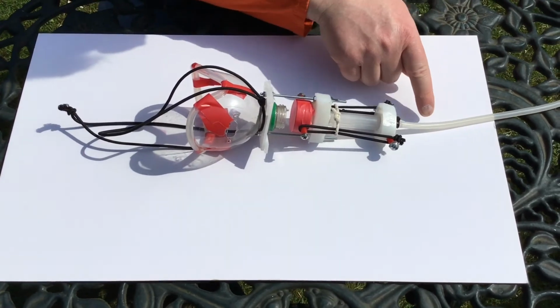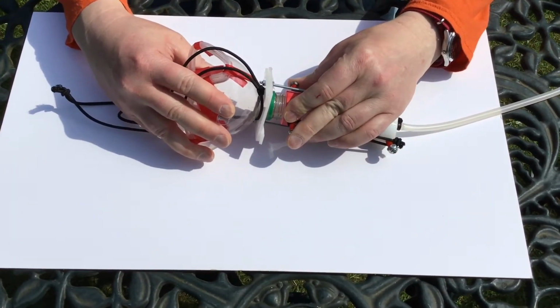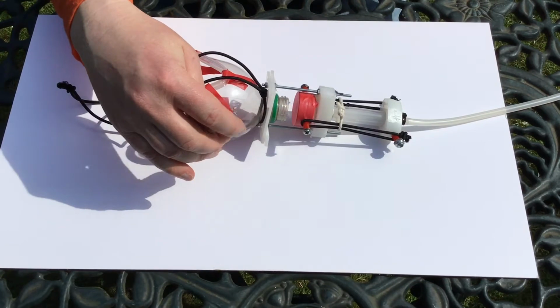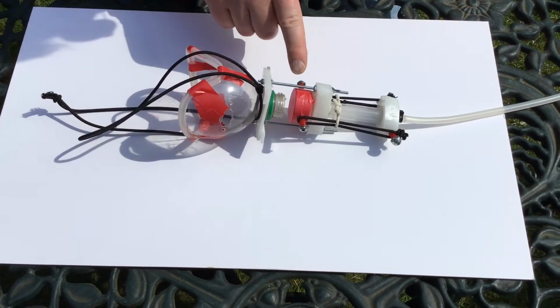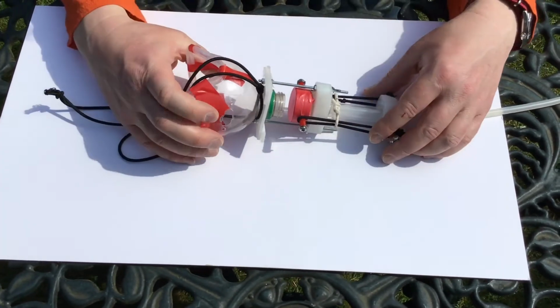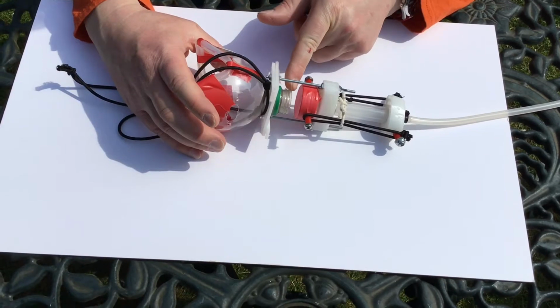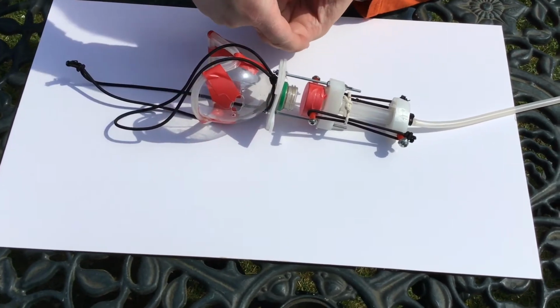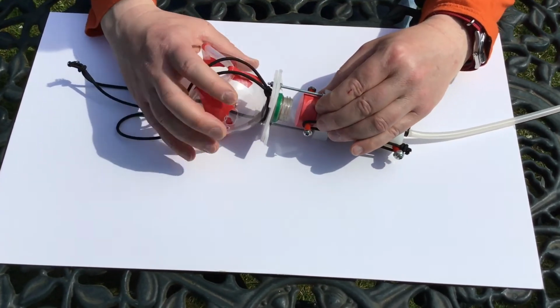Here we have the syringe, which is pneumatically powered to seal the exhaust valve here, and elastically retracted to open the exhaust valve. Here we have a very crude inlet port which doesn't work very well. We have elastic to hold it to the person's head, and we have just two supports holding the syringe to the face mask, which allows it to float a little bit and hence helps the self-aligning characteristics of the valve against the valve seat. To hold the syringe to the bottle we have 2 C plates which clamp around the collar on the neck of the bottle, so that the syringe can't pull away.